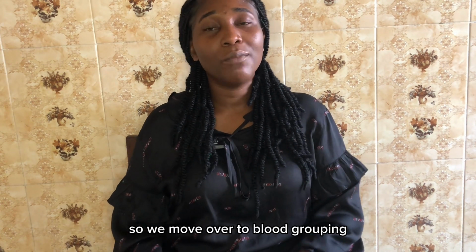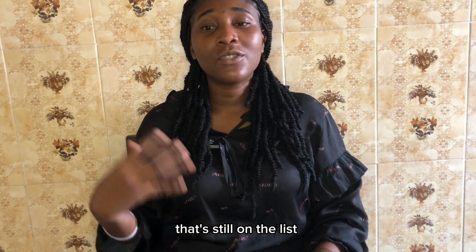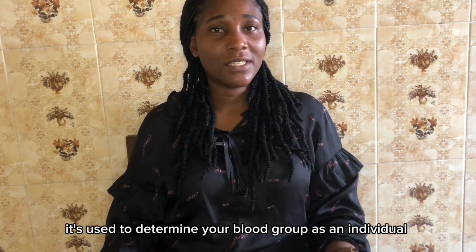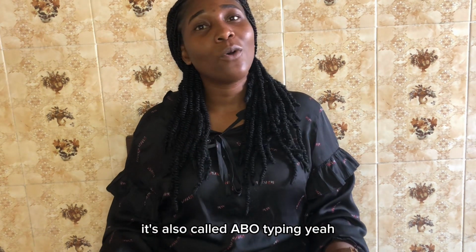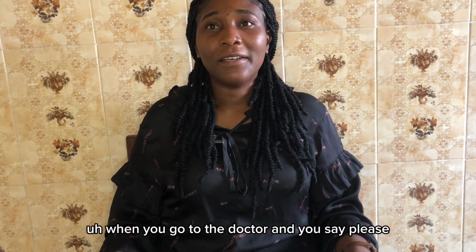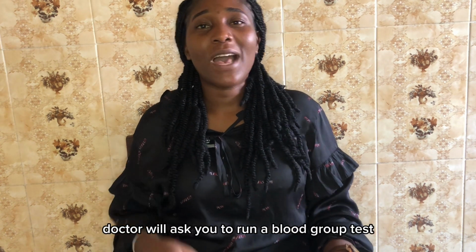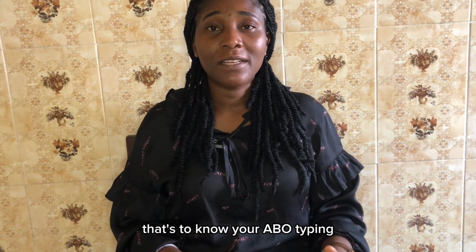So we move over to blood grouping. Blood grouping is done to determine your blood group as an individual. It's also called ABO typing. So whenever a patient doesn't know his blood group, when you go to the doctor and you say, please, I don't know my blood group, the doctor will ask you to run a blood group test. That's to know your ABO typing, to know your own blood group as an individual.